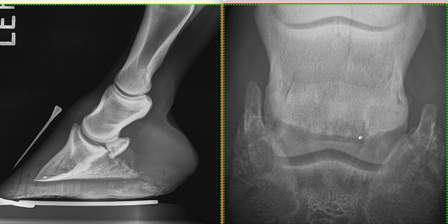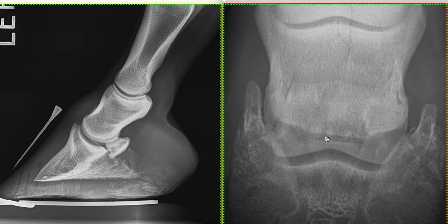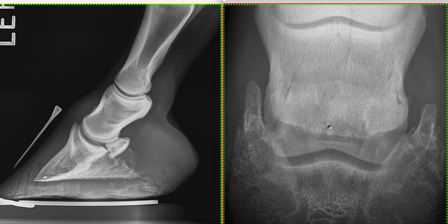The dogma is that we would expect seven small evenly sized synovial invaginations. Now I can see one, two, three, four — but these look very big. They're very irregularly sized and shaped. We've got one sort of Y-shaped one here, and we've got another lollipop-shaped one here, and then we've got these two very, very big invaginations here, and actually these extend down to here.